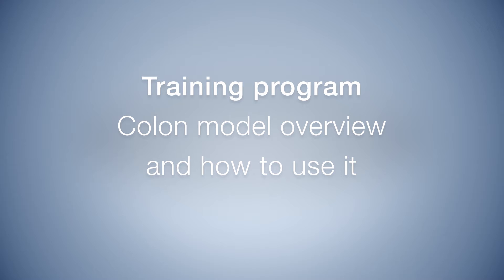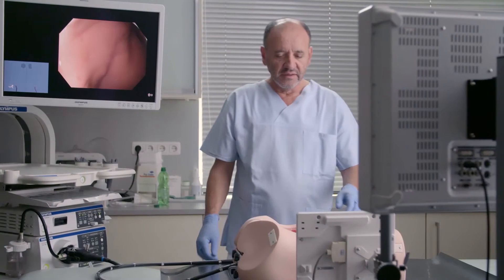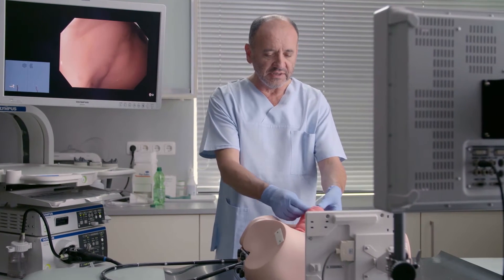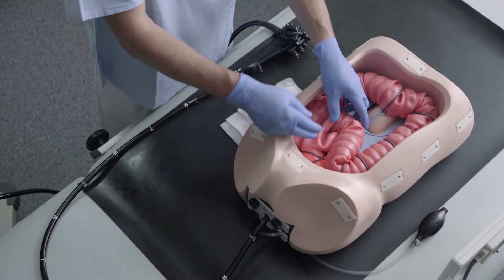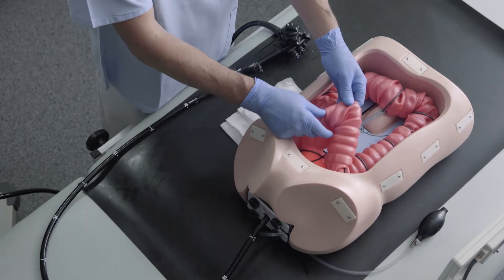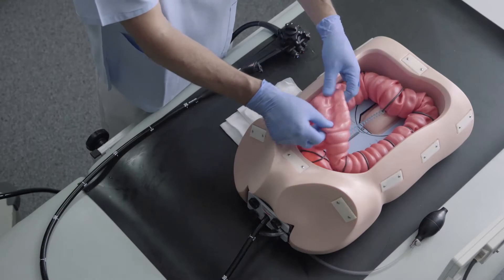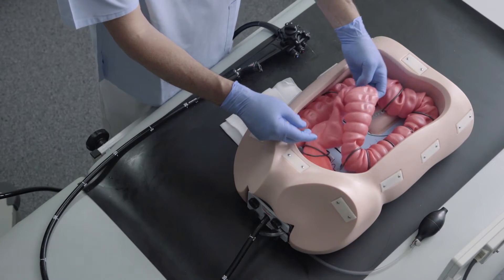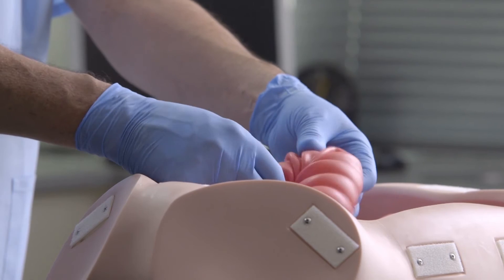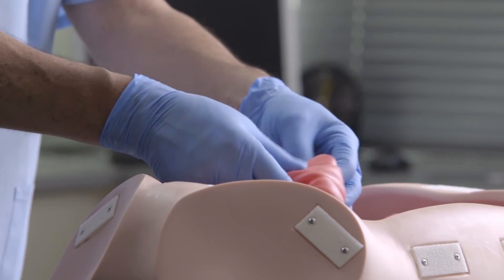Here we have the model CEM15, and as you can see, it is in a way quite similar to the human colon. Of course, this is rubber, but this is a very flexible sigmoid, and this is where the most difficult part of colonoscopy is.